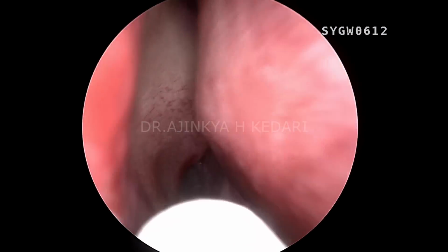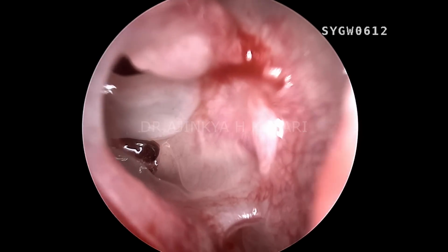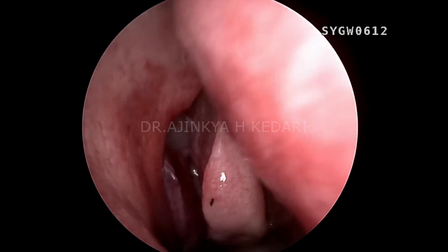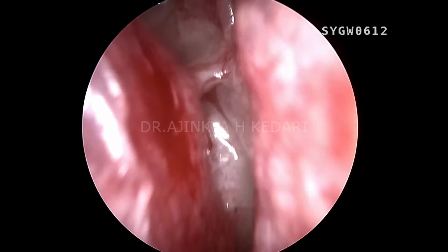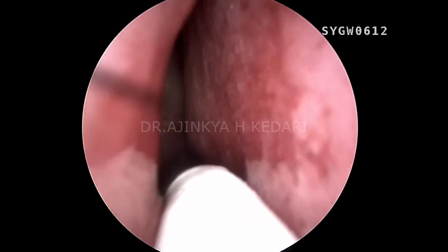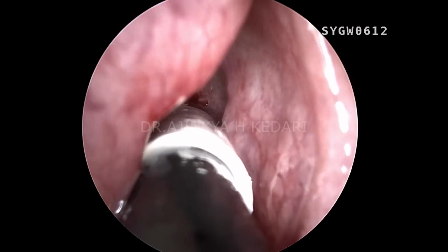We cannot see the actual defect right now, but we can see the CSF leak happening, and this is at the level of the axilla, which we can see right now. You can see that's the middle turbinate at your 3 o'clock, and that's the possible defect area at your 11. You can see I'm giving a lot of nasal washes just to have a clear picture inside. Make sure you hold the endoscope erect, don't tilt your endoscope, otherwise it's going to give you a false orientation.